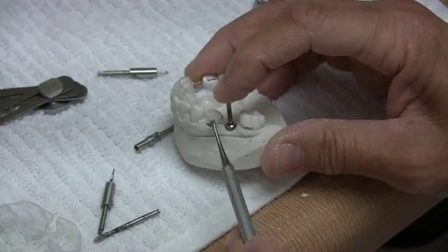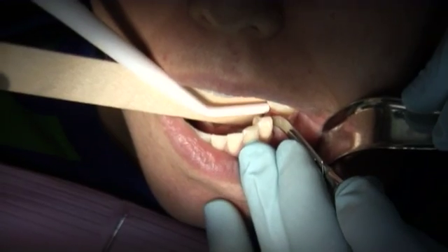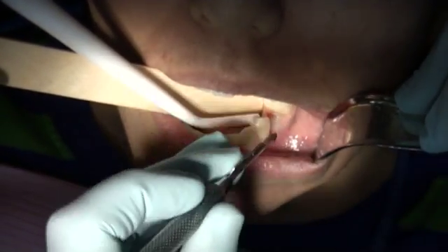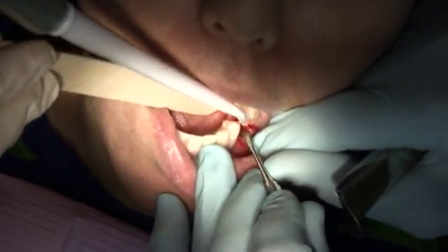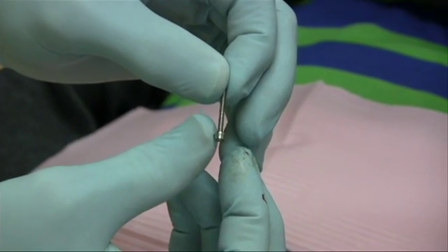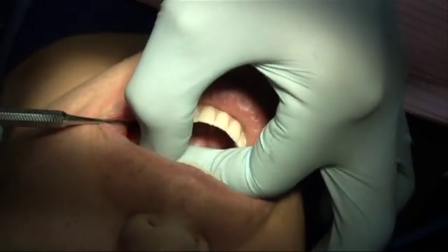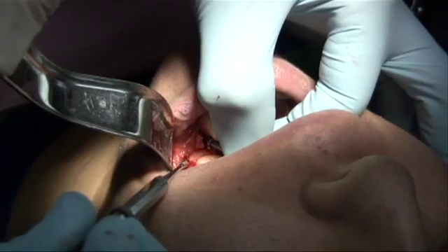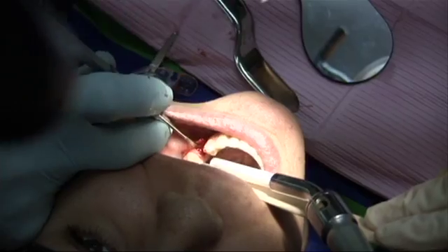I would now like to demonstrate the use of the gauge during a surgery. In this surgery, papillary sulcular incisions are made to expose the crest of the ridge. Next, the collar is rotated to the apex of the gauge, and the platform is evaluated in reference to the interproximal tissue and CEJs of the adjacent teeth.